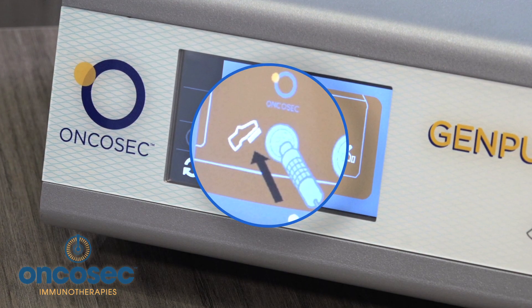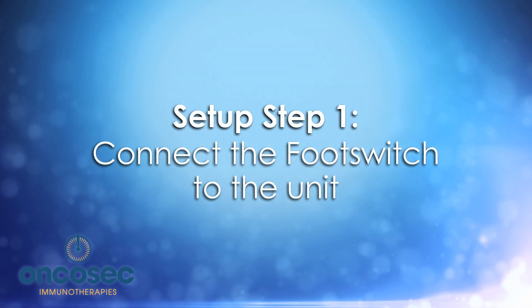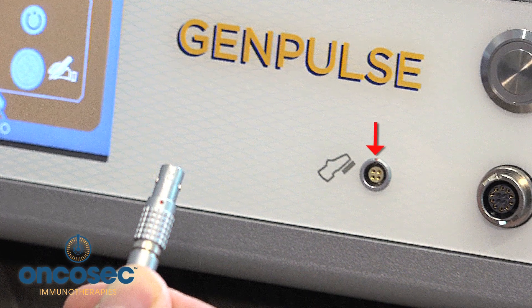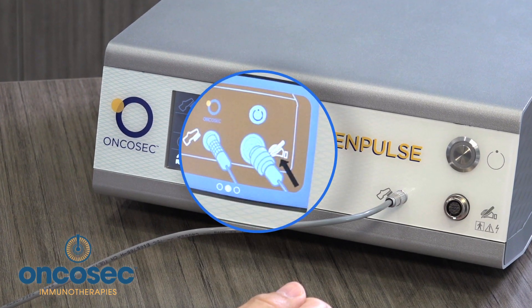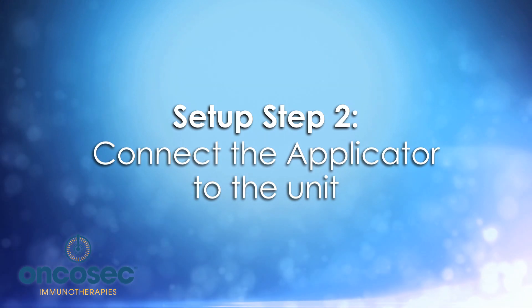The user display currently tells you to go ahead and connect the foot switch. The red dot on the cable tells you to align the red dot on the face of the generator. After the foot switch is connected, the generator will tell you the next step, which is to attach the applicator.